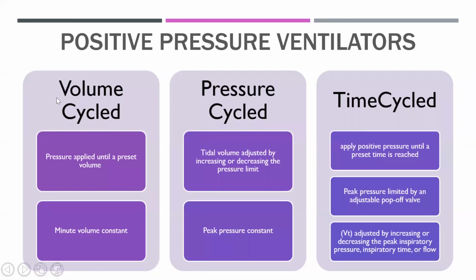Okay, we will have here the volume cycle, the pressure cycle, and the time cycle. The volume cycle means that I set my volume and the pressure will be applied until the tidal volume is delivered. The minute ventilation here will be constant.